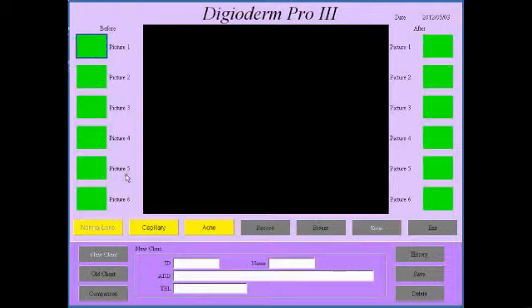After you've taken the pictures you can fill in your client or patient's ID, date of birth, name, address, and telephone number, and click save. This is a full-fledged database so you can search for patients afterwards, find all the pictures, add to their pictures, compare pictures, etc. It also has the ability to view underlying capillaries, and if you have the acne lens you can click on a little button and it will highlight the acne for you.